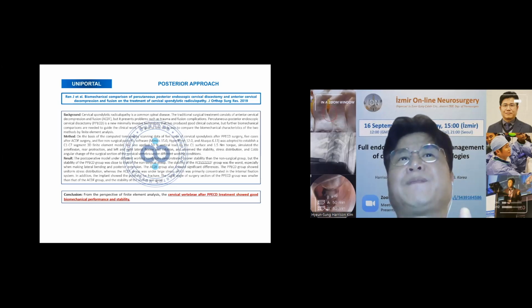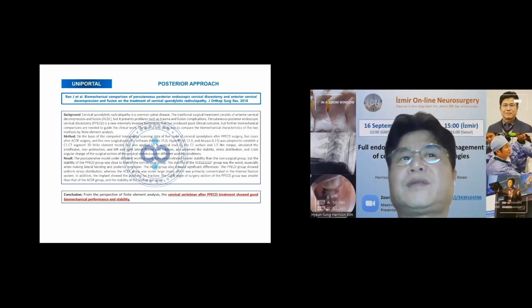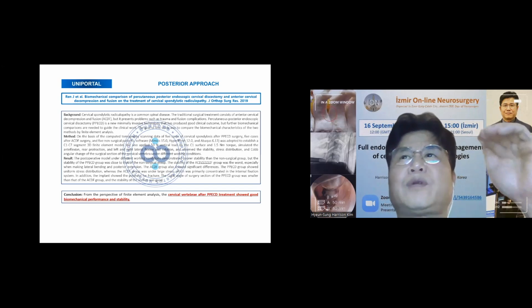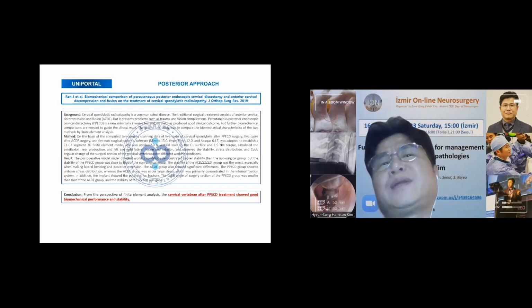Because of that, I think that maybe that preserves the skin, muscle, and all structures. Because of that, there is stabilization, not aggravation after surgery. In spite of more than 50, 60, 70, and some patients 80, instability does not happen. That is true, I will show. That is very important.